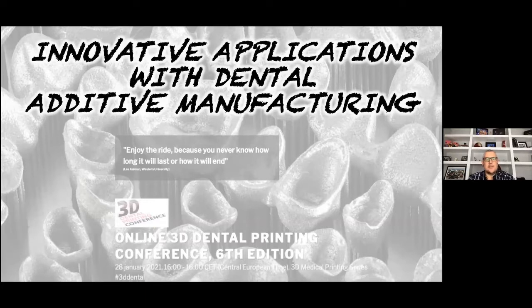And I just wanted to share a little bit of our research that we've been working with in terms of additive manufacturing with dental applications.